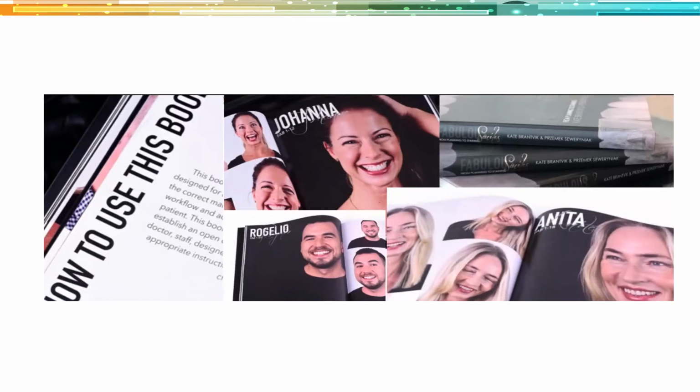And it's interesting because if you have a patient that's looking for natural kind of aesthetics, we don't have to apply one kind of wax up to their teeth. If you're using a laboratory that's using physical wax ups and they're building wax by hand, if you have a really experienced dental technician, they may be able to do a couple of different styles of wax up.